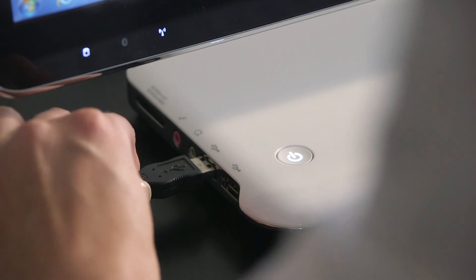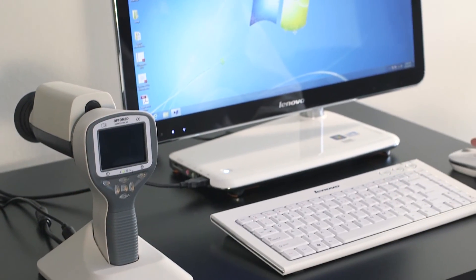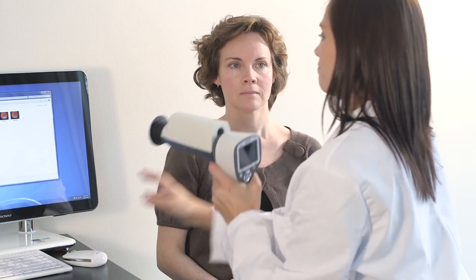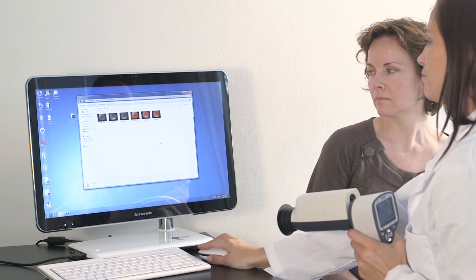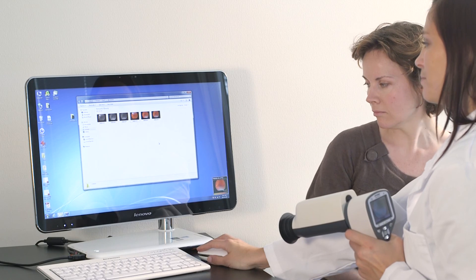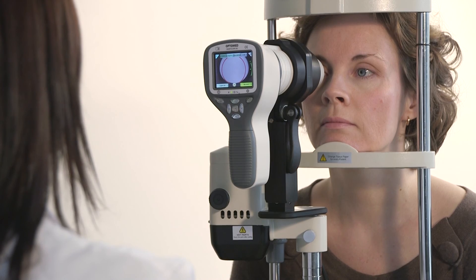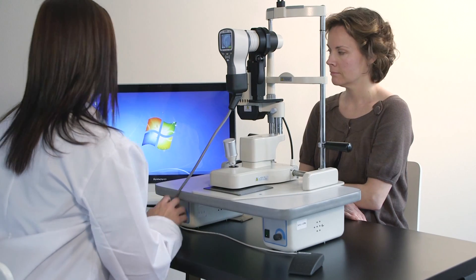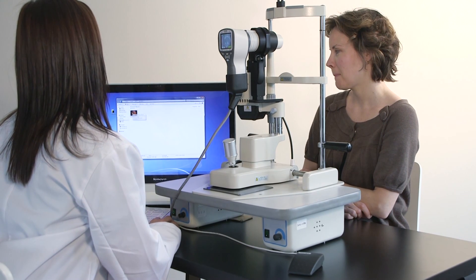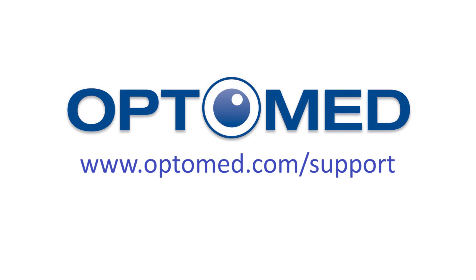Images are uploaded to the computer by placing the camera on the cradle. Image transfer works through USB connection in a similar way as with any other digital camera. It is also possible to transfer images with Wi-Fi, as the taken image will wirelessly appear on the computer screen right after the image has been taken. If the camera is mounted on the slit lamp, the image can be transferred to the computer with the slit lamp cable and will appear on the computer screen right after capture. If you need any help, please visit us at www.optomed.com/support.